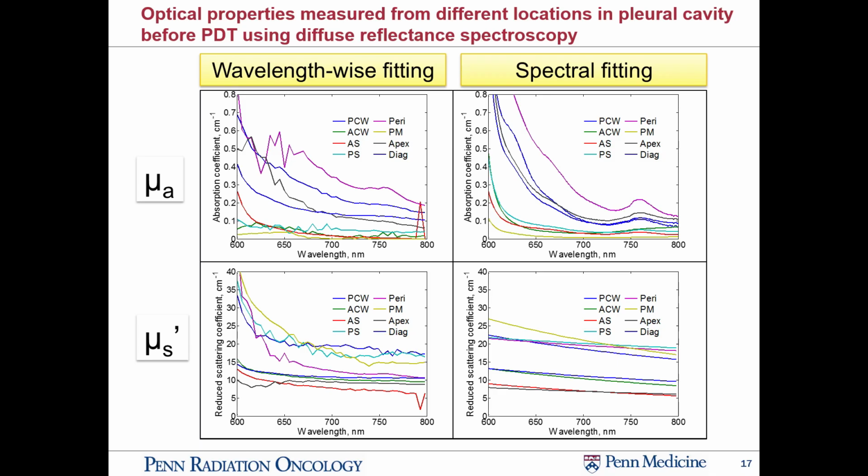So this is what we're going to do in the future, use spectrum fitting to reduce the uncertainty in the wavelength range. Certainly that should improve the result, because we are now taking into account the wavelength dependence of the absorbance, which is not taken into account in this individual fit.